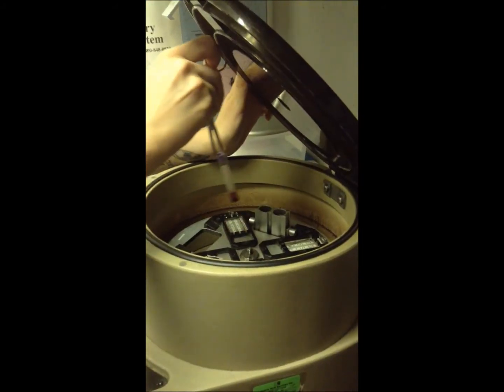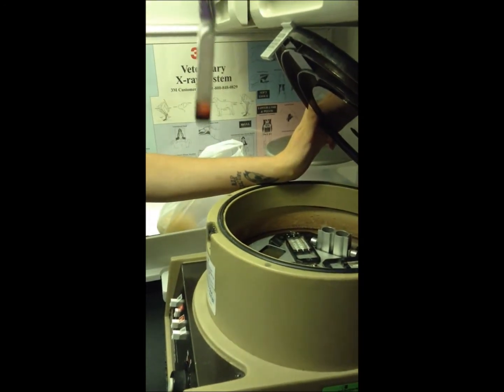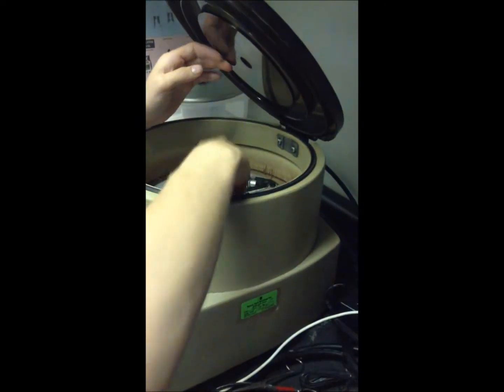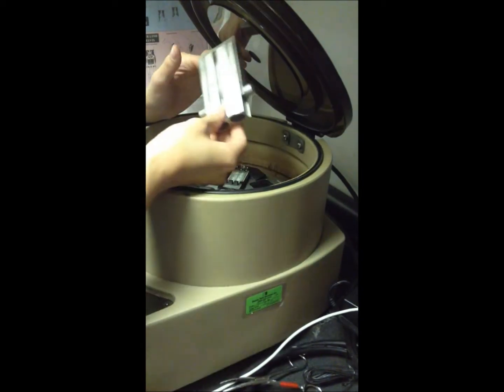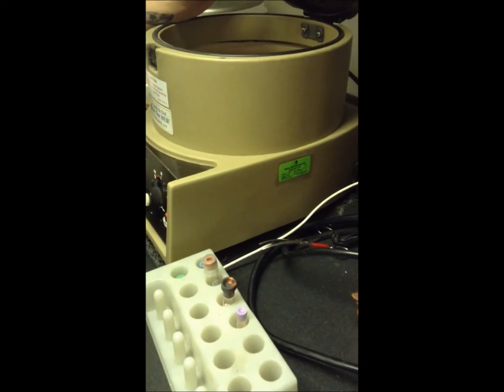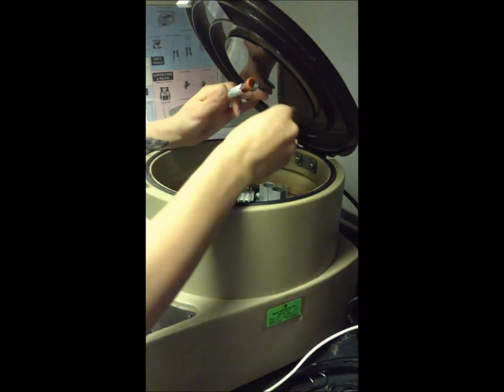Okay. Removing the lavender top with a hemostat so you don't remix the plasma with the blood. And I'm just going to place it into here. And then we're going to take out the serum separator as well. And then we're going to place in the recipient's blood, Ethel, and we're going to place it the same way, evenly.